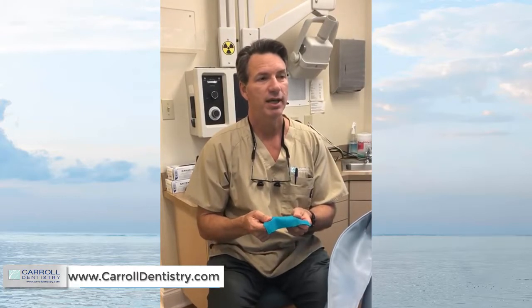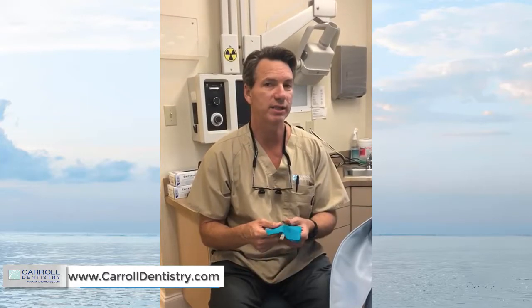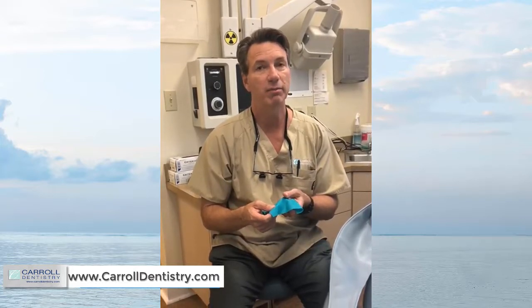I was trained as a prosthodontist and we did not train with rubber dam. I did not use a rubber dam for the first 20-something years of practice, but since becoming a BioClear dentist, I use rubber dam a lot. It has some really distinct advantages for BioClear and the BioClear matrix system and the BioClear method.